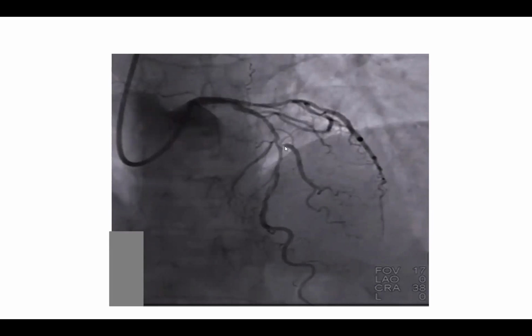This is what we call provisional predilatation or post-dilatation, meaning dilatation before you put the stent or dilatation after you put the stent. I will use those terms a lot. Predilatation, meaning dilatation of the side branch before main branch stent, and post-dilatation, side branch ballooning after main branch stent.